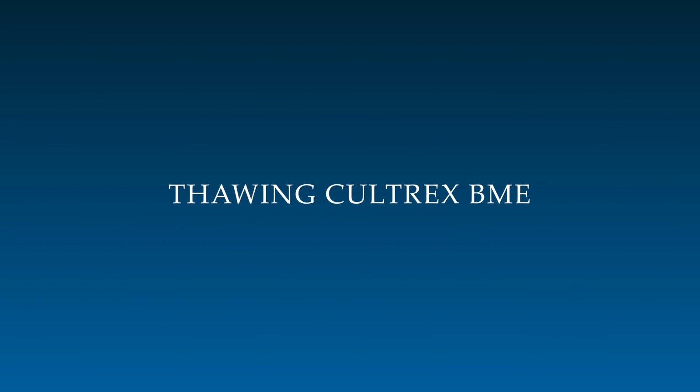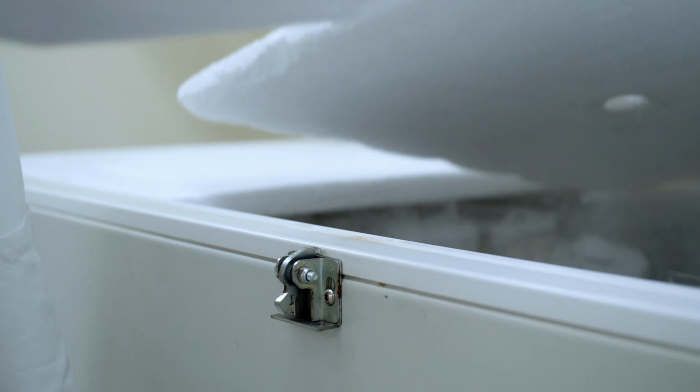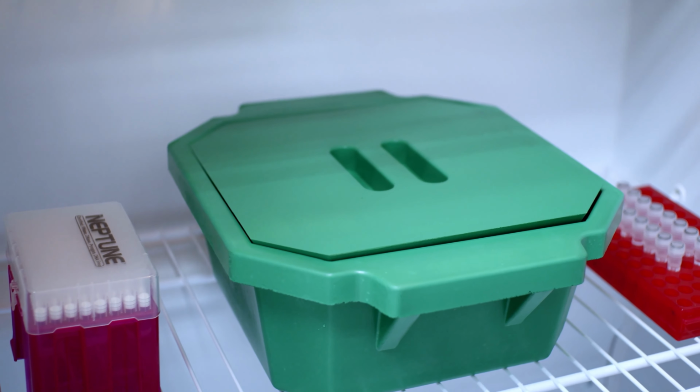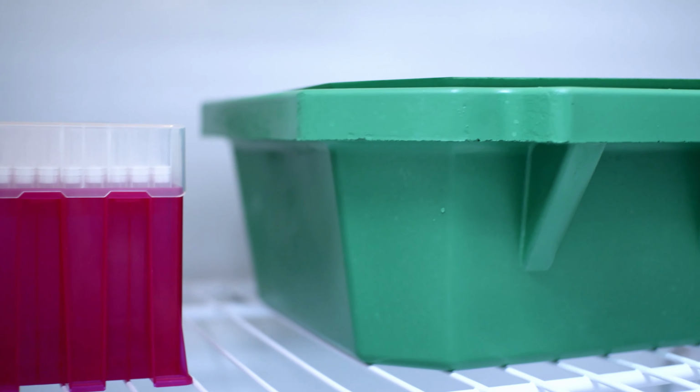Cultrex BME should be maintained at -80 Celsius for long-term storage. To thaw Cultrex BME, remove a vial from the -80 freezer, submerge it in ice, and place it in a refrigerator overnight. We recommend placing pipettes, cryovials, and other materials needed to aliquot or dilute Cultrex BME in a -20 Celsius freezer so that they are chilled prior to use.